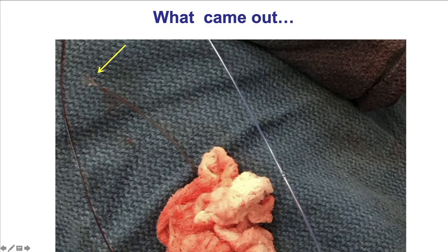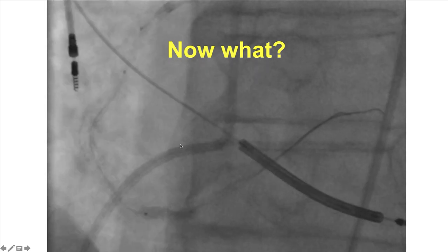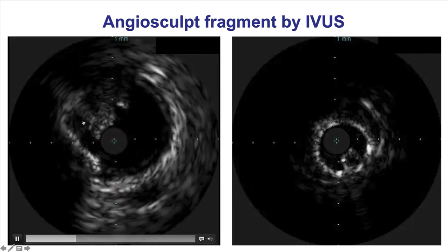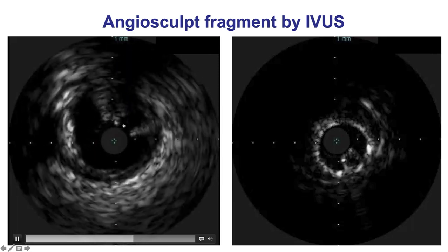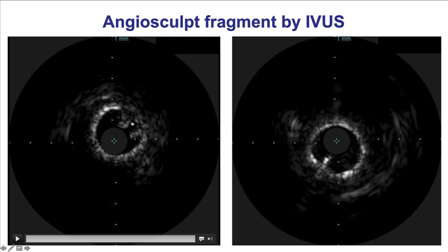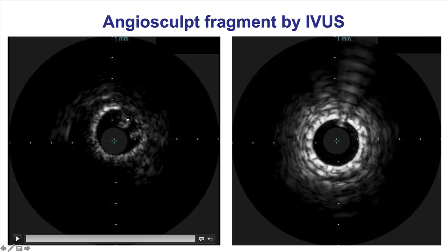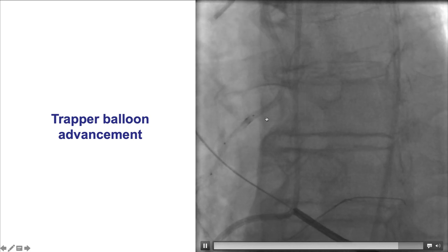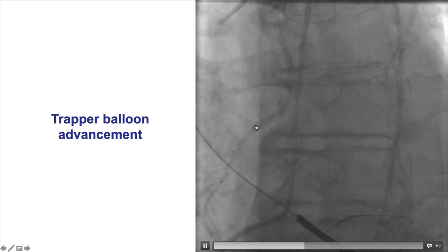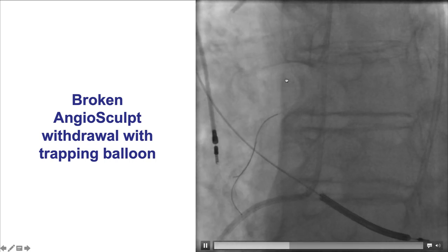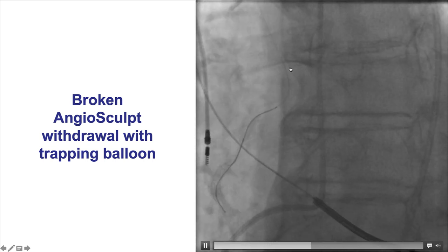The anchoring balloon was still in place. The distal segment of the angiosculpt balloon remained in the proximal right coronary artery. Intravascular ultrasound was performed to confirm that enough of the balloon segment extended back into the guide catheter. A trapper balloon was then advanced into the distal portion of the guide catheter, fully inside, and inflated. The entire system was then withdrawn, and the entrapped angiosculpt nicely came back together with all the guide wires.